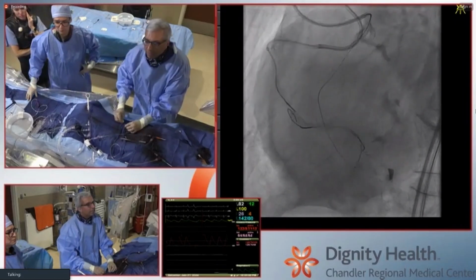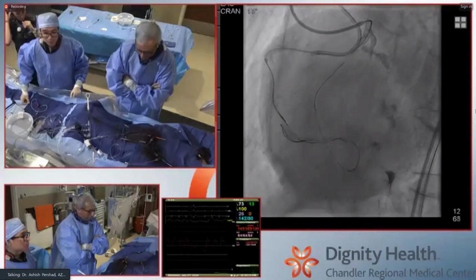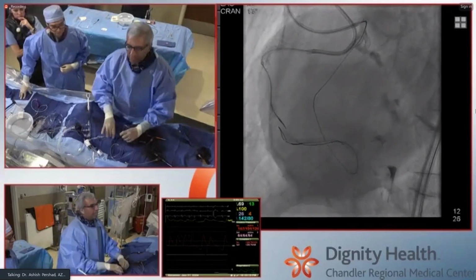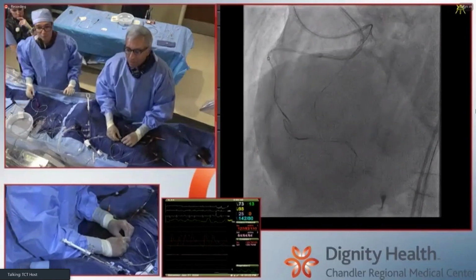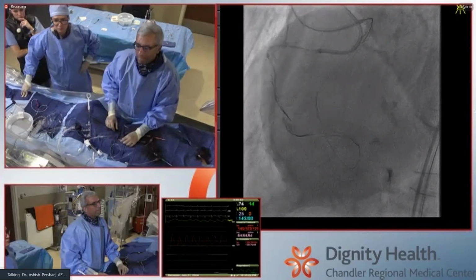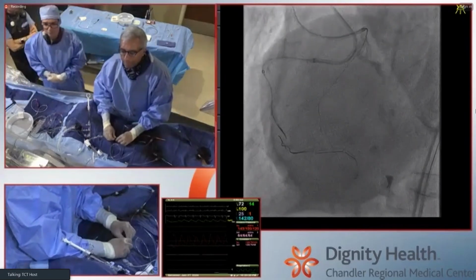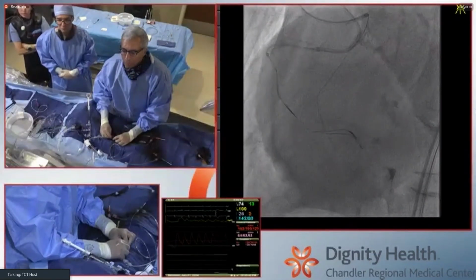Well done. I'll just verify it. I would pull the retro microcatheter back so you can see a little, and maybe even get a workhorse down to make sure. I guess the only jeopardy in taking the workhorse approach now is that if you're wrong, you're going to go past the bifurcation with your microcatheter to get the workhorse there. Which is why, you've got a nice secure retrograde knuckle and long ways. Just pull your retrograde back and then use whatever wire you're in under direct visualization to wire antegrade down the PDA, and then you know you're there.